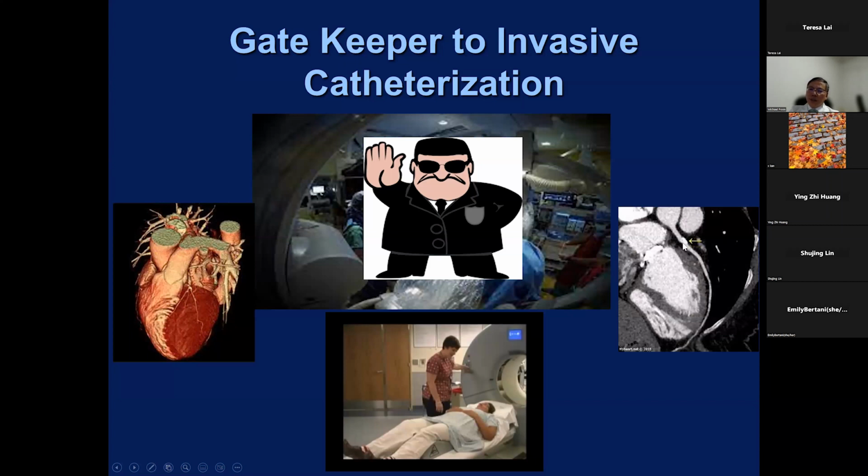You can see that this patient has a calcified white plaque sitting at the proximal portion of the coronary. This is very important information because now you know this patient needs to be on medical therapy and be very careful to make sure that this individual keeps the bad cholesterol, the triglyceride, the hemoglobin A1C, and the blood pressure all within normal range.